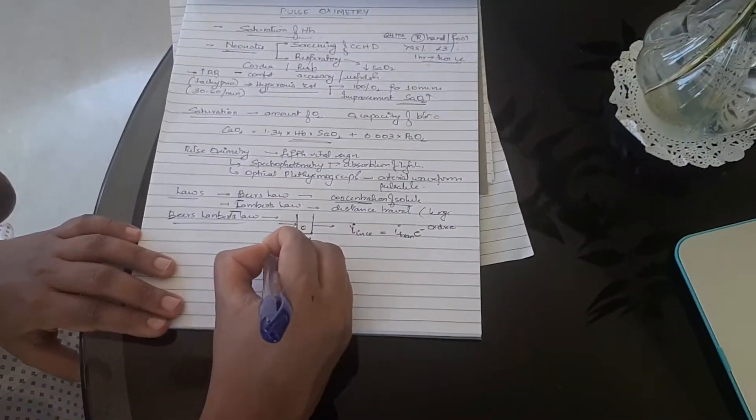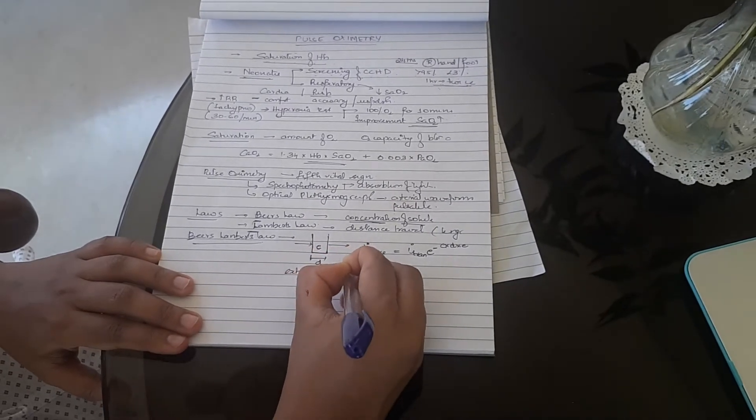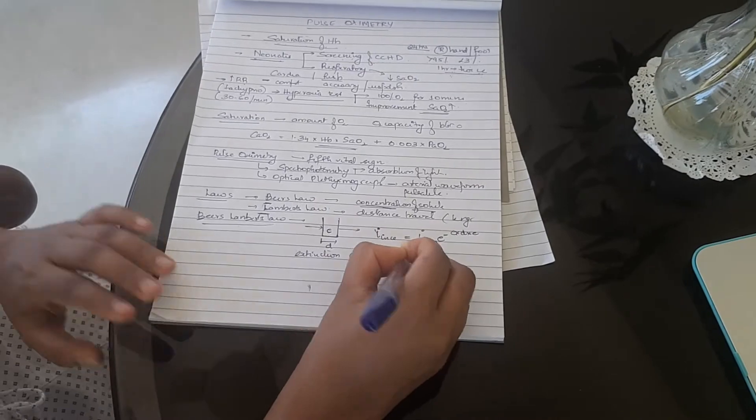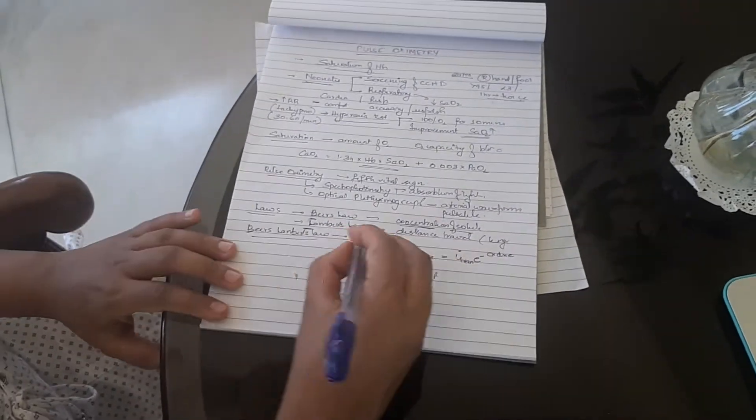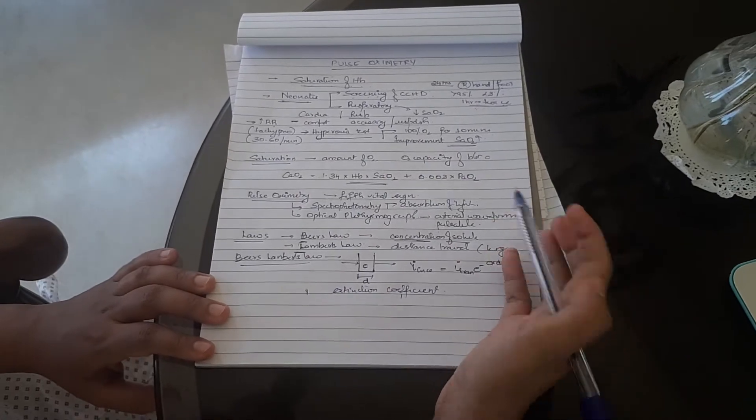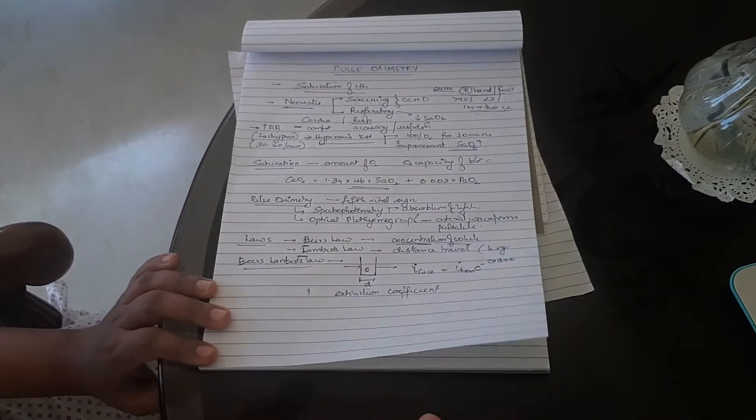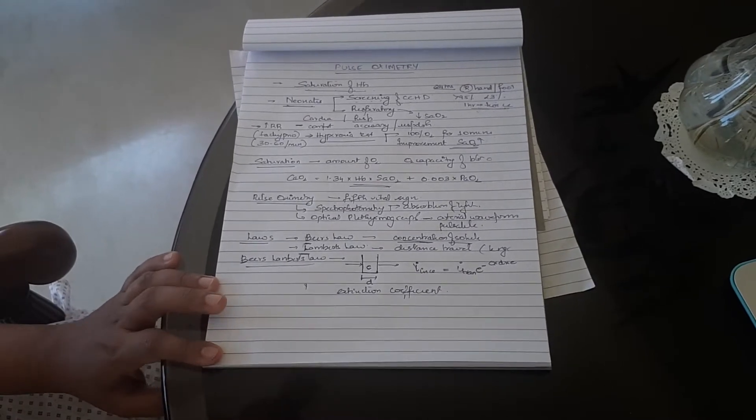E is basically a constant called the extinction coefficient which is different for different substances depending upon the amount of light they have a tendency to absorb. So you are seeing how much incident light is transmitted through the cuvette and based on the amount absorbed you calculate the concentration of solute.